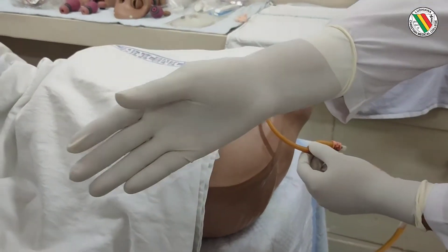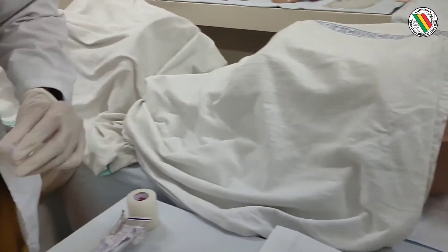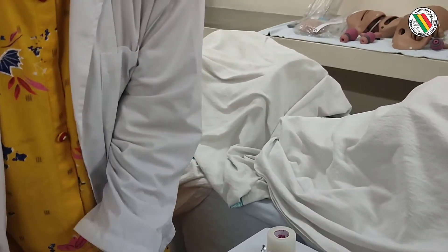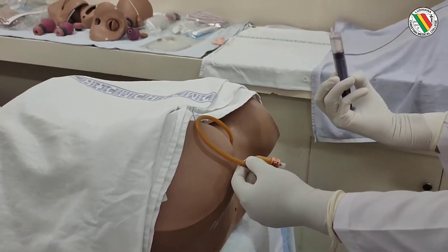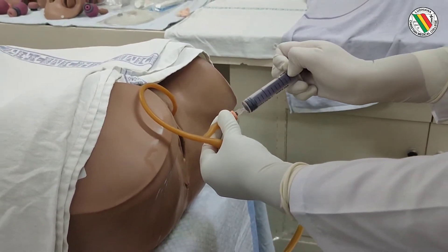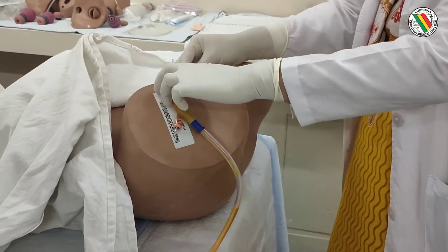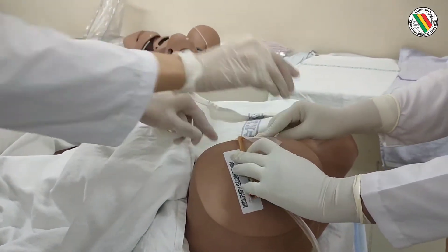You can advance the catheter inside and then inflate the bulb with 10 to 15 ml of distilled water or saline. This inflating of the bulb with 15 ml ensures it snugly fits. The catheter is then strapped to the thigh without any tension.